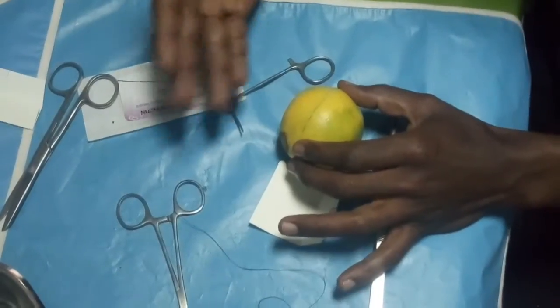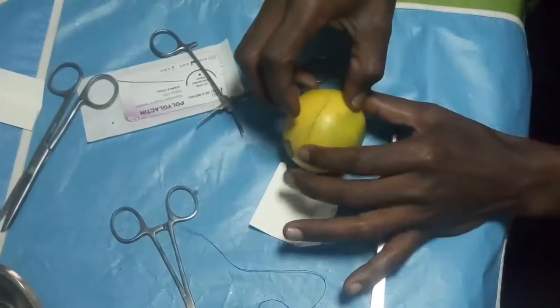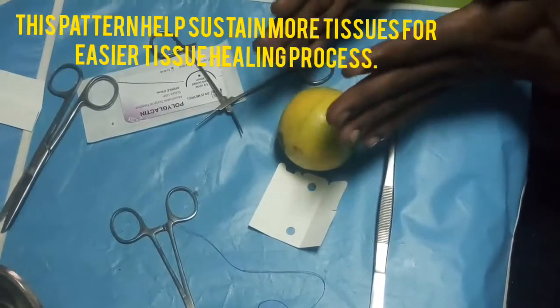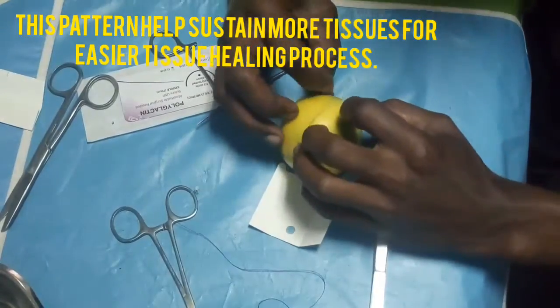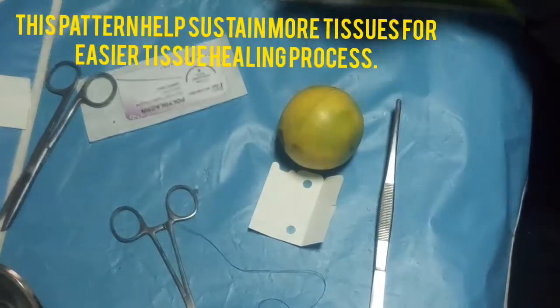We call this the simple interlocking pattern. This is able to hold more tissue because there is a larger area of tissue injured. It's not the same as the superficial one. So we use a pattern that holds more tissue, which is called the interlocking pattern.